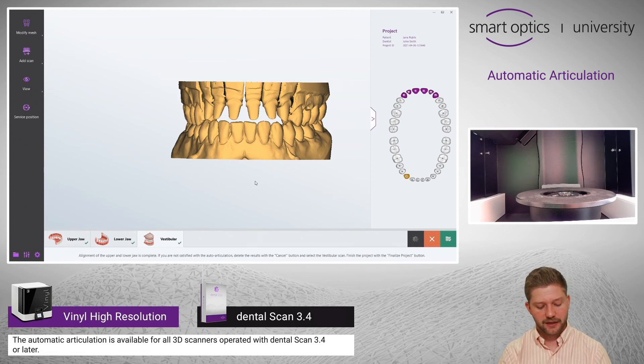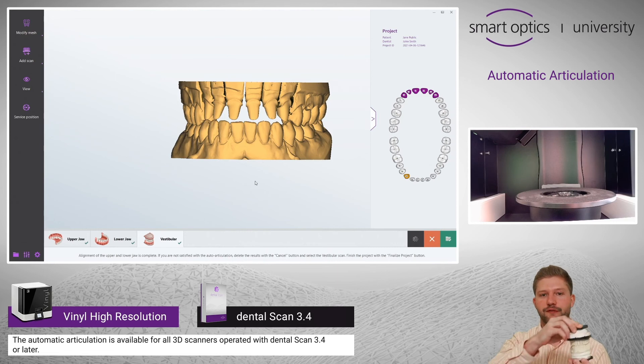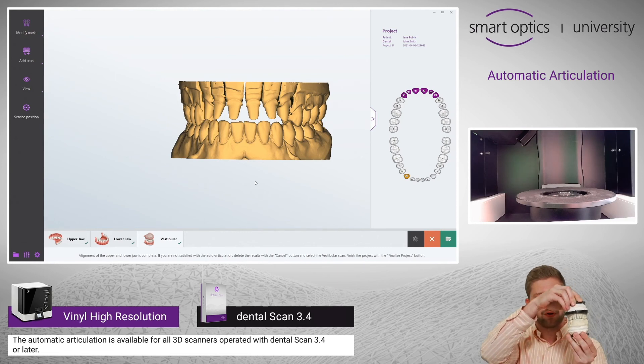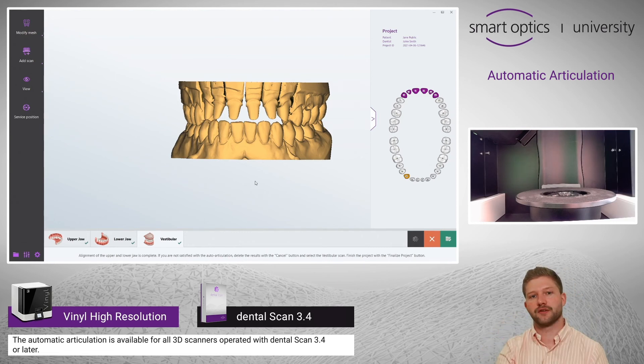As a little hint, if you can find the articulation with your hands, the software is also able to find it.